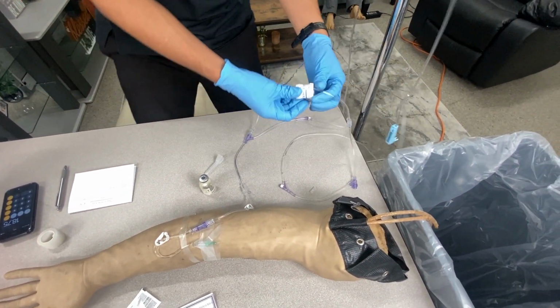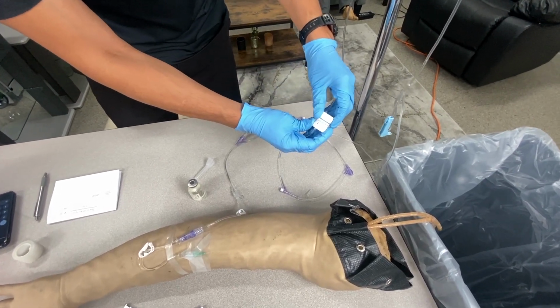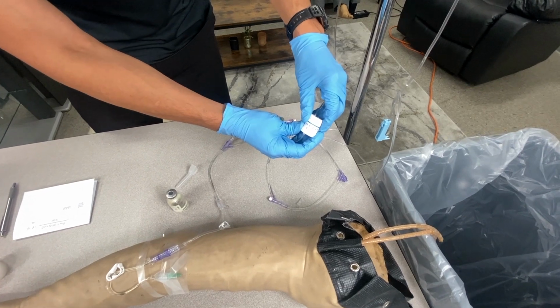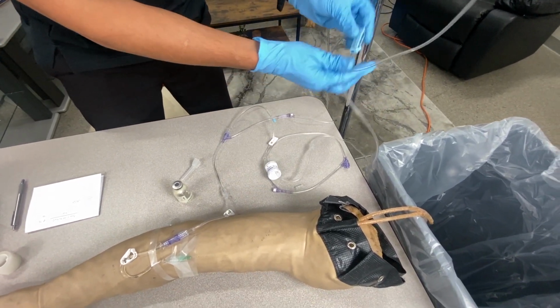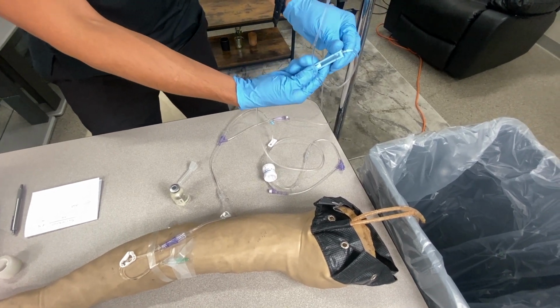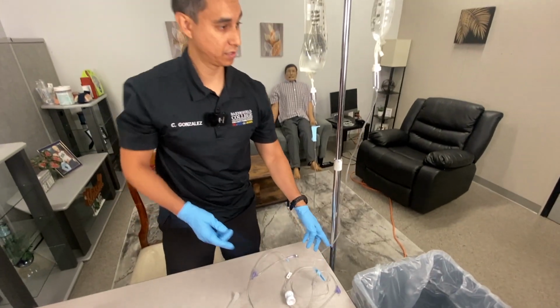Alrighty. So we're going to go to the dial-a-flow, and we're going to move it to roughly 19, and we are going to open the clamp, allowing the medications to be administered into the patient.